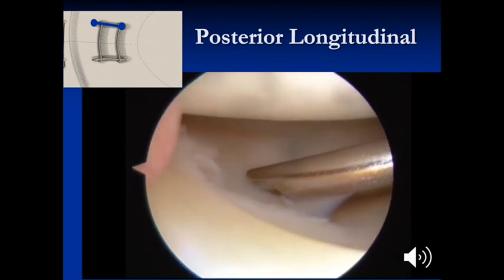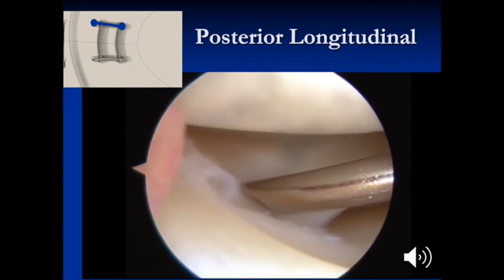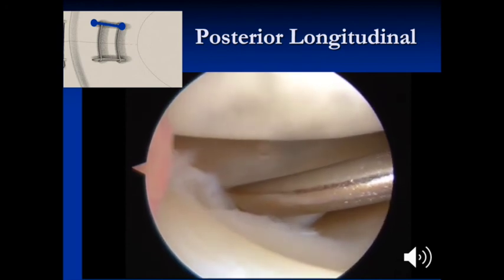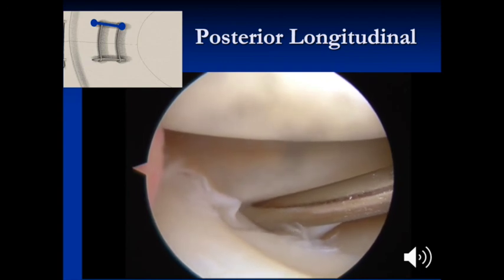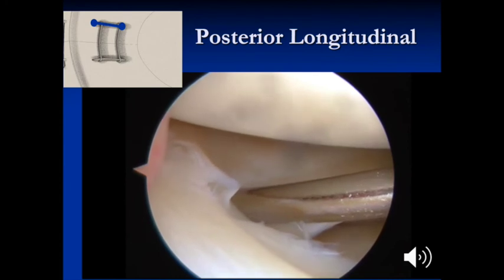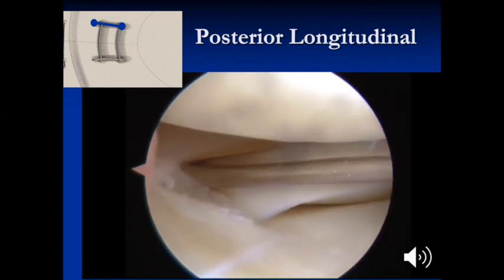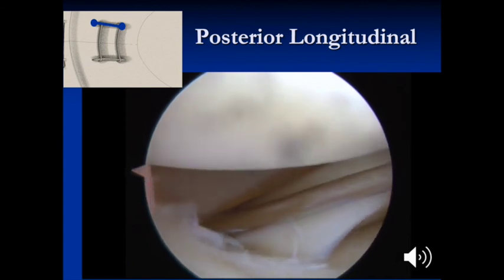The needle is advanced into the meniscus a few millimeters, and then the guide is placed more anterior in order to aid in reducing the meniscus tear. As the suture is pulled through the capsule, this will aid in the reduction of the tear. Next, the outer suture is placed.